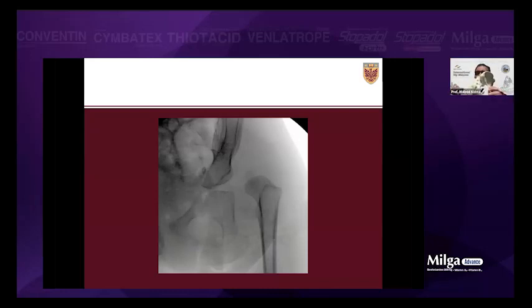And here's the sciatic notch. I'm not sure if you can see it with a small camera. So this is the inner table, the sciatic notch. We put the Homans in. Because of the background, I see the picture is not stable, but at the sciatic notch, make sure both metals meet each other. Some people use radiolucent Homans, which is very helpful. We don't have it in our institute.